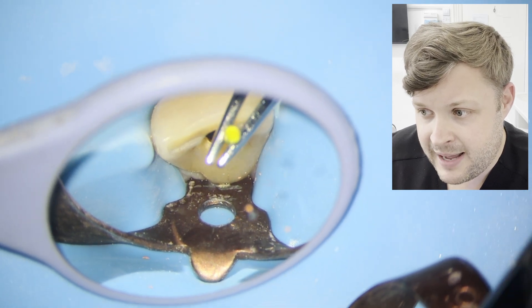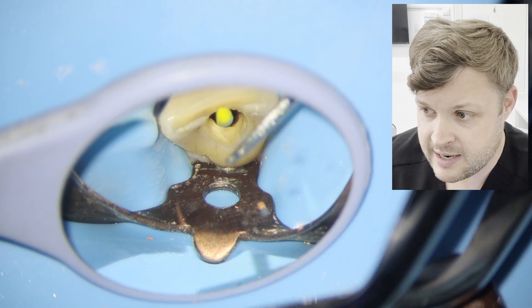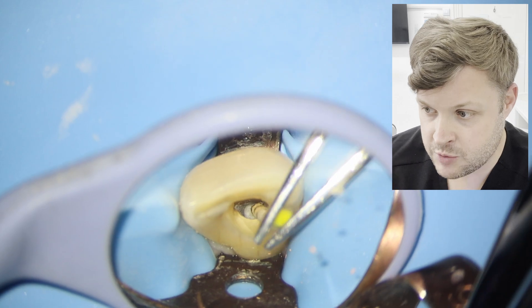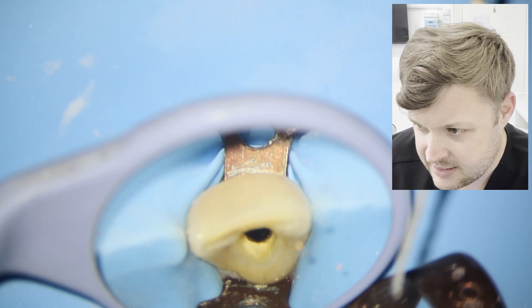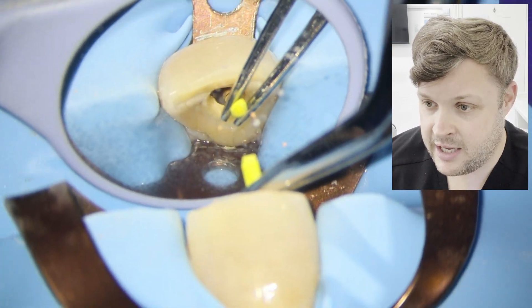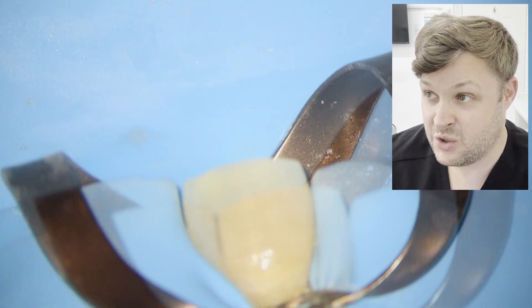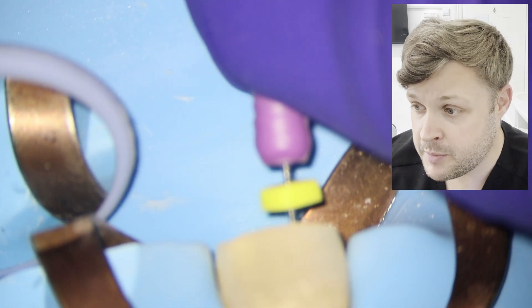I believe there's a tiny little bit of GP left. I'm wicking out the moisture from the irrigant just so I can visualise the GP a little bit more — you can see the tiny little bit left there. I'm trying to remove it with H files but also using irrigation and active irrigation. You'll see that activating the irrigant with ultrasonics causes that little piece to just remove by itself. All the GP is now removed.